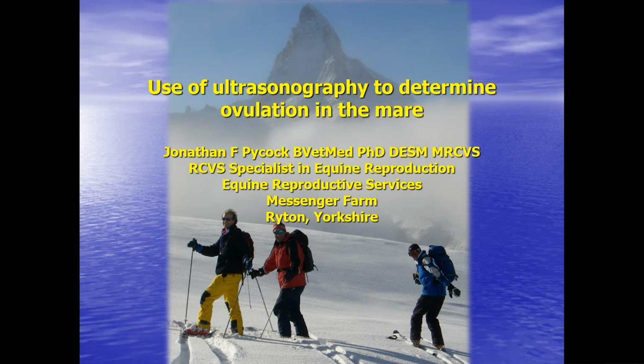And there's no doubt that ultrasonography has proven a really useful tool in helping us do this. Over the next half hour, 40 minutes, I want to present some of the information I've learned over the years using ultrasound to try and assist you and give you some little tips and tricks to effectively use ultrasonography to determine ovulation.